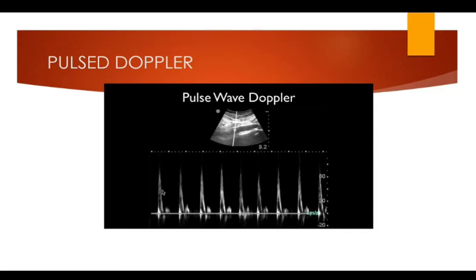And so we can see over time, this is definitely an arterial flow, has a nice peak, has a nice rebound. So these are positive deflections. If you watch the Doppler effect or the color Doppler video, you'll understand that this is flow towards the probe, and then this is as it goes away and then comes back. And so you get the flow coming through the aorta, a high peak flow as you're through systole, and then that little bit of, not contraction, but rebound of the aorta to get you a little bit more here on the back end.